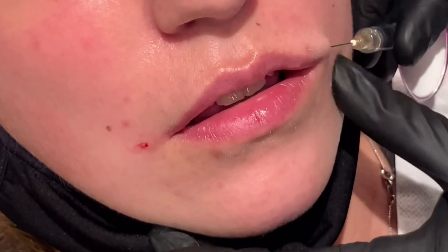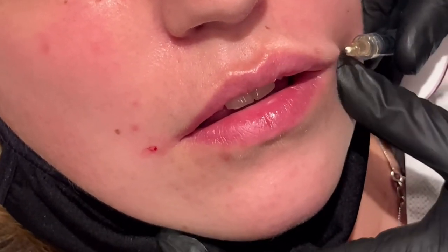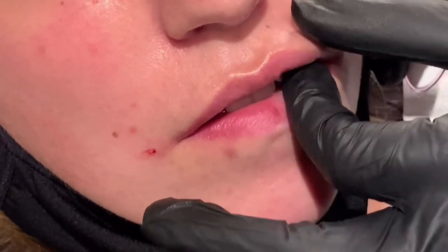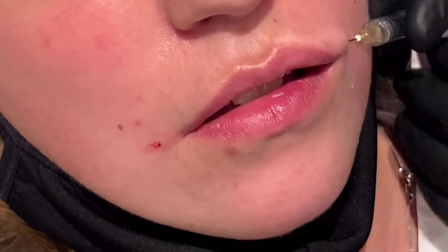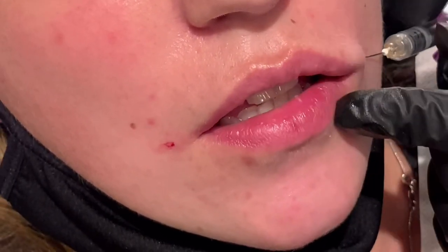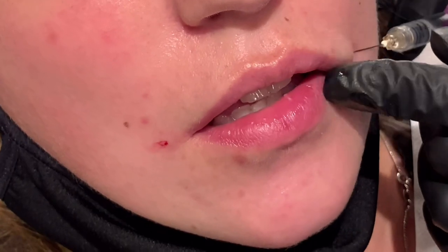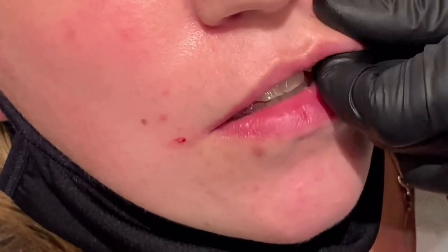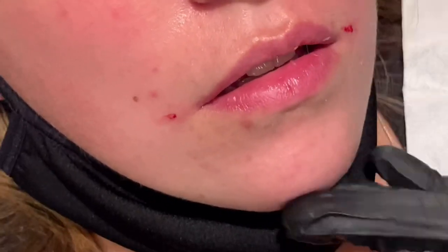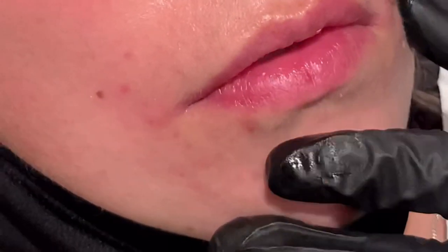It's expected to have some resistance whenever you're doing the cannula, and that's because you hit some septi. The trick is, instead of just forcing the cannula through, I pinch the lips with my index and my thumb and guide the cannula through. It makes it a lot easier on the client and yourself. Then once I'm finished, I massage out any lumps and bumps just to smooth everything out.